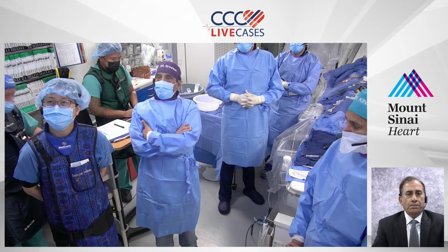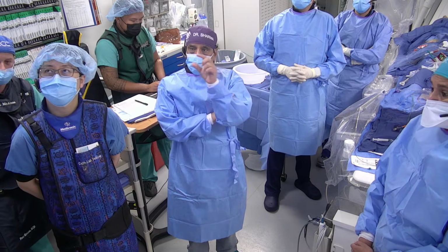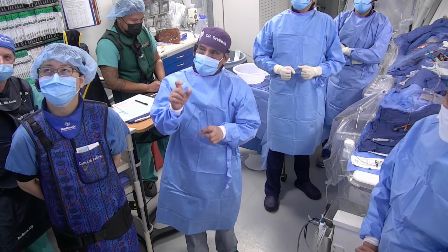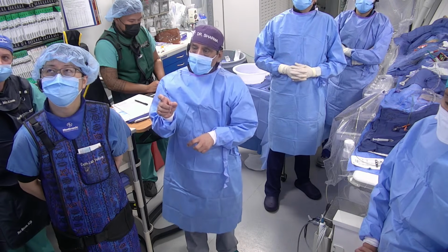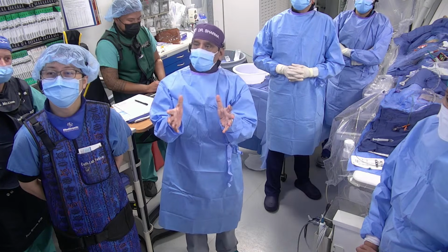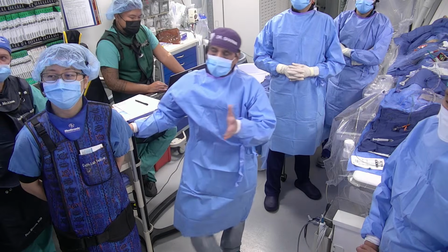No, so that is why in the provisional stent group, anywhere from 13 to 46% need a second stent. And the second stent is precisely needed for this purpose. So what you do is, if your side branch gets a significant plaque shift, first you do a kissing balloon. If it doesn't get better, then you put a second stent. And that could be anywhere from 12 to 46%.